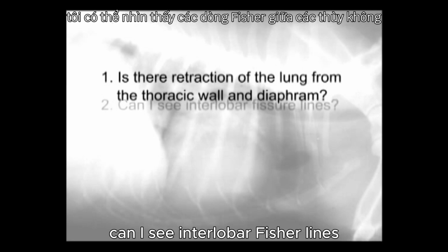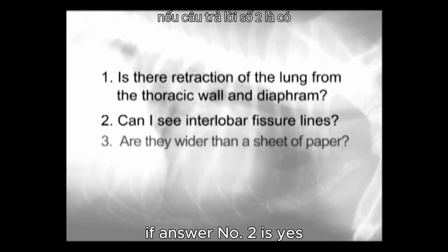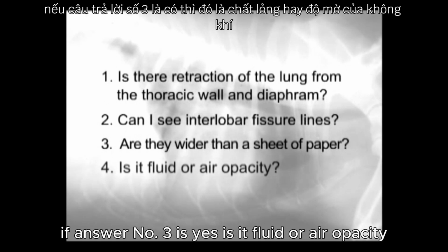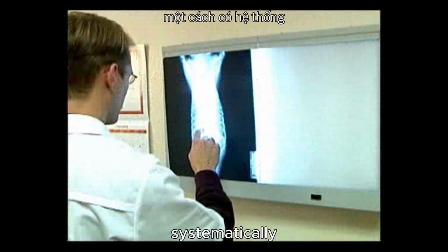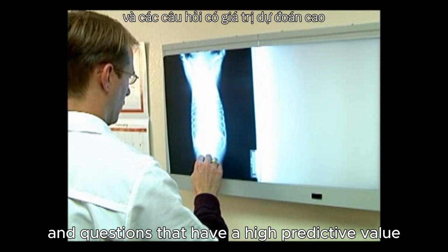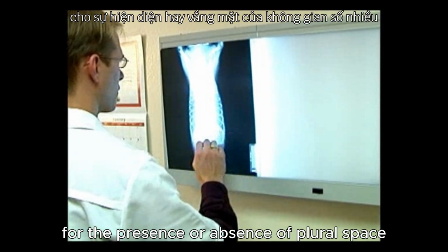Can I see interlobar fissure lines? If answer number 2 is yes, are they wider than a sheet of paper? If answer number 3 is yes, is it fluid or air opacity? Systematically asking these questions will keep you focused on areas and questions that have a high predictive value for the presence or absence of pleural space abnormalities.